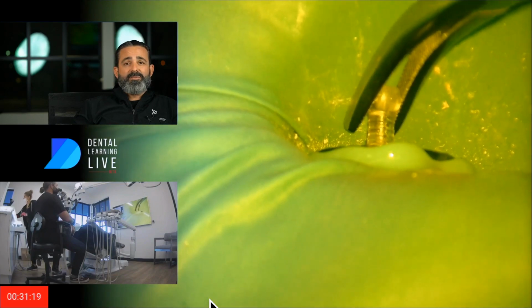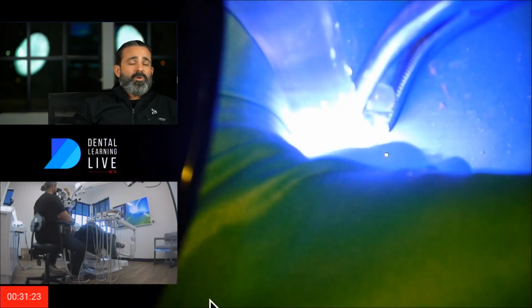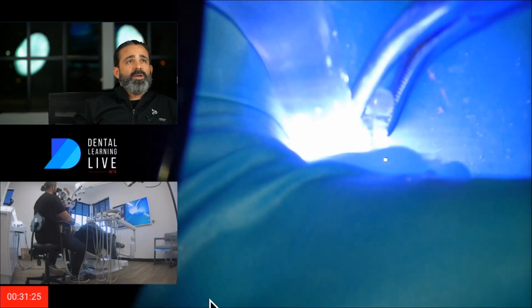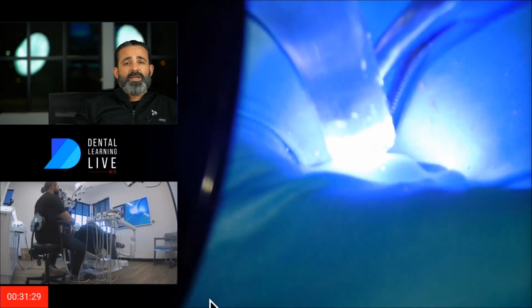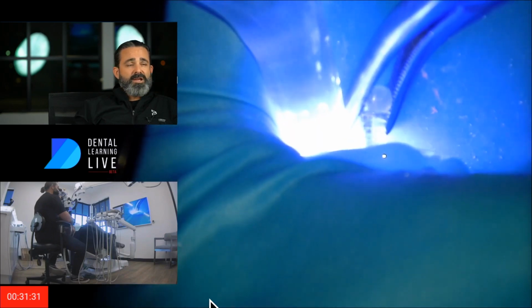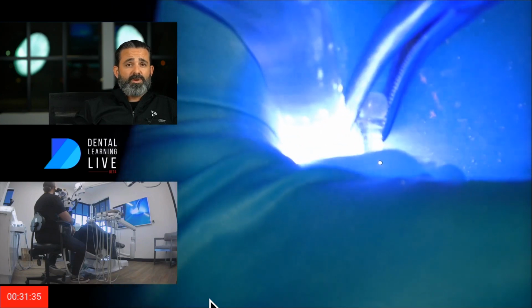The patient needs to move, some people are gaggers, or the tongue's gonna play with me along the way. I mean, this patient's really compliant. It's fantastic actually, but I build them all for failure, right? I build them so they can withstand the storm. I don't want to chase the storm. I want to withstand the storm.